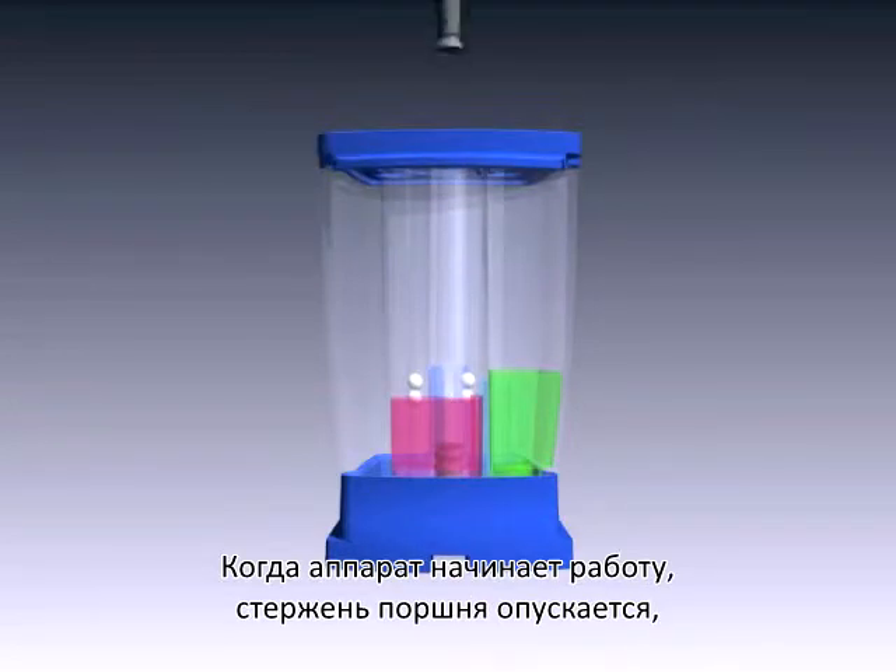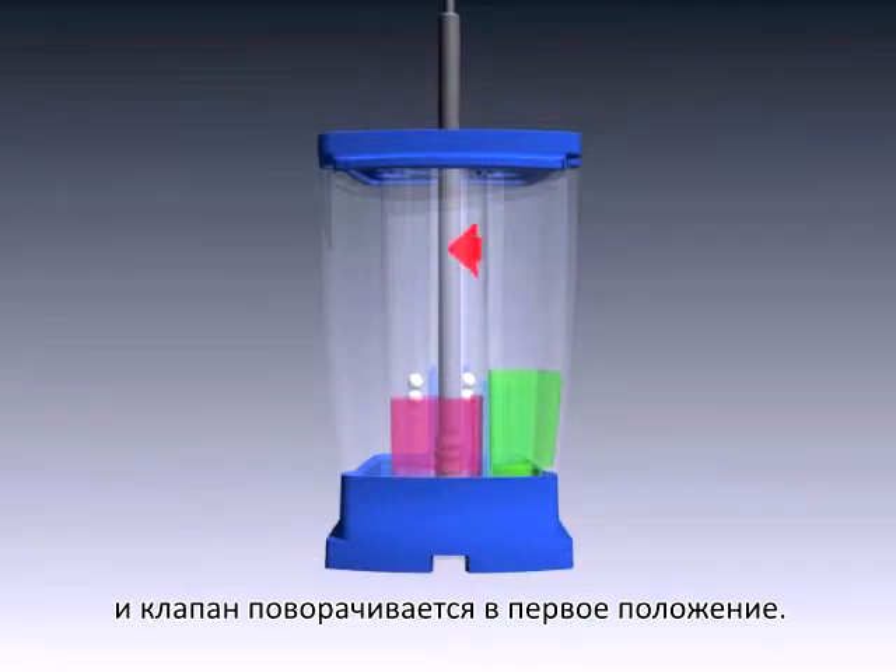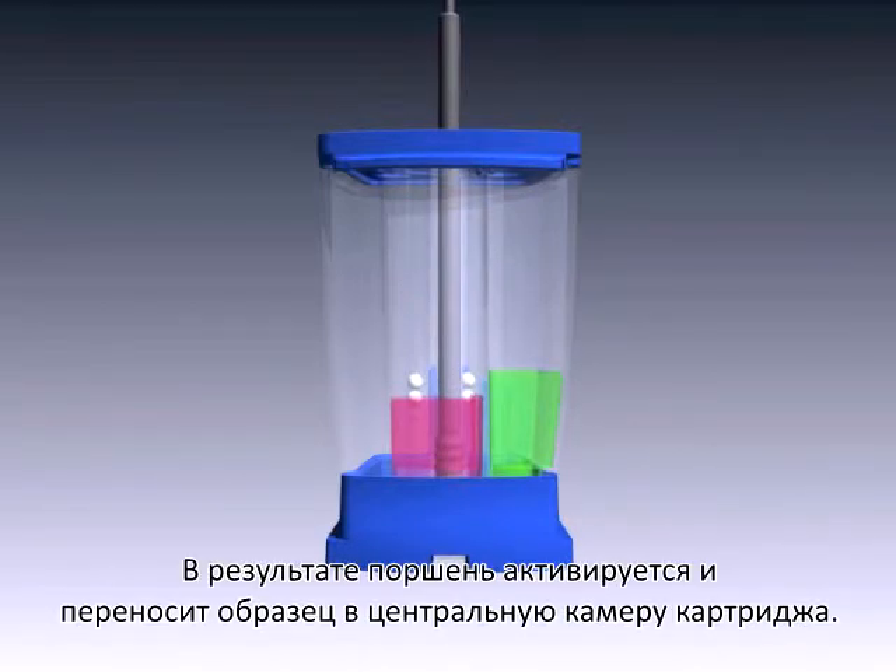When the instrument begins, a plunger rod lowers and the valve body rotates to the first position. It activates the plunger, which draws the sample into the central tube.